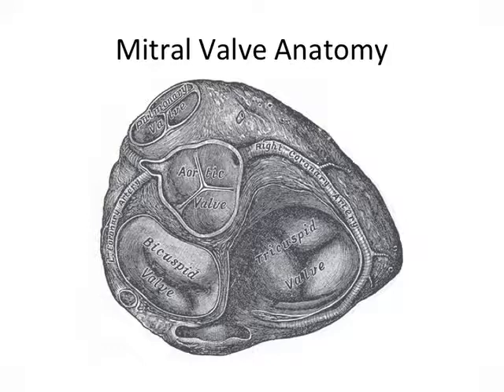The mitral valve is encircled by a fibromuscular ring, the mitral annulus. This annulus is saddle-shaped and plays an important role in closure of the mitral valve. It is also important to understand that the coaptation between the two leaflets of the mitral valve is not linear. Indeed, that coaptation is C-shaped and must be imaged by TEE in multiple planes so as to obtain a more complete picture of the structure and function of the mitral valve.